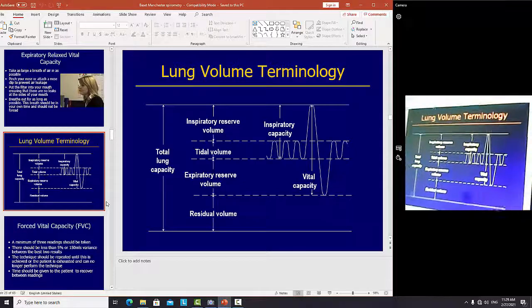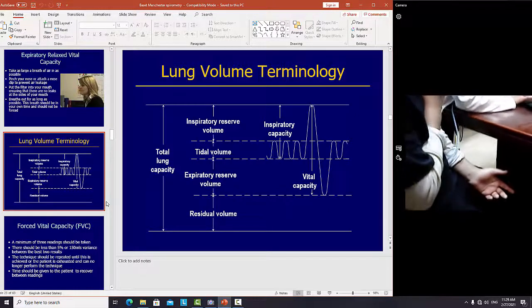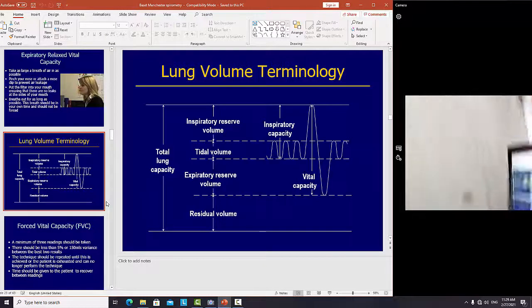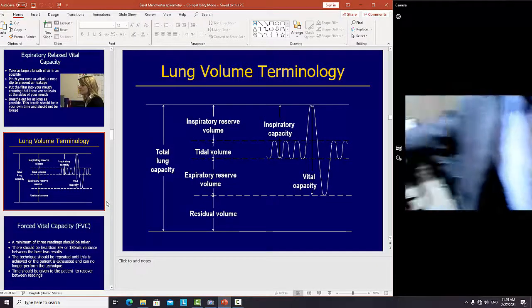Okay. When we start this tidal maneuver, the patient can breathe tidal. Okay, you can also, when the patient starts the tidal maneuver. Yes, again, Hassan, to the computer.